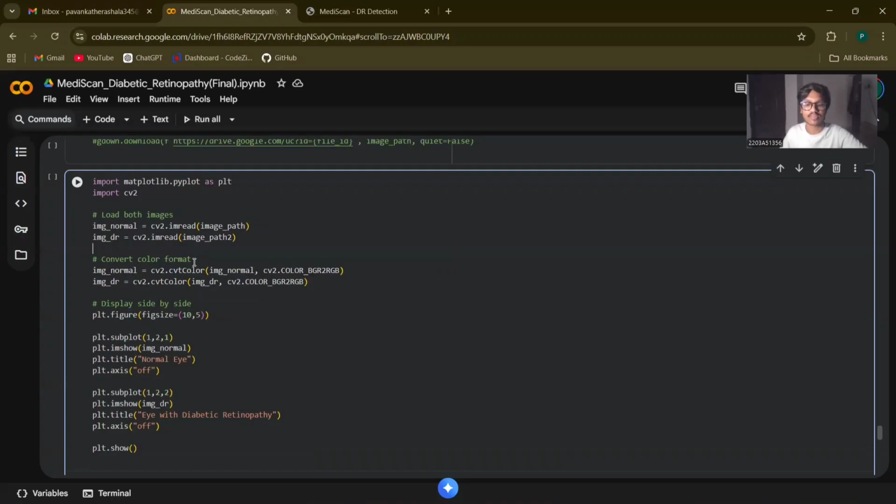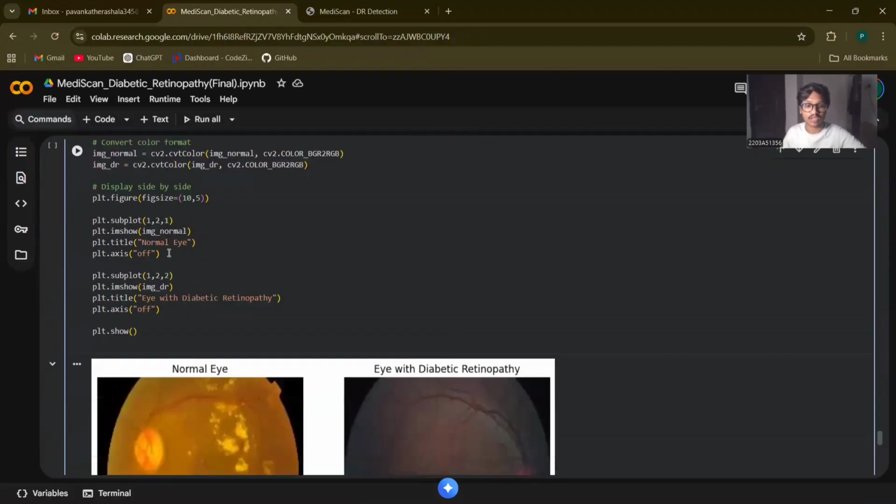Before plotting, we must convert the images from OpenCV's default BGR order to the standard RGB order used by most other tools, including Matplotlib. Without this step, the colors in the displayed images would look unnatural, like blue areas would look red and vice versa. So here, we display them side by side. We use Matplotlib to create a figure and display the images. This setup displays a window 10 units wide and 5 units high.